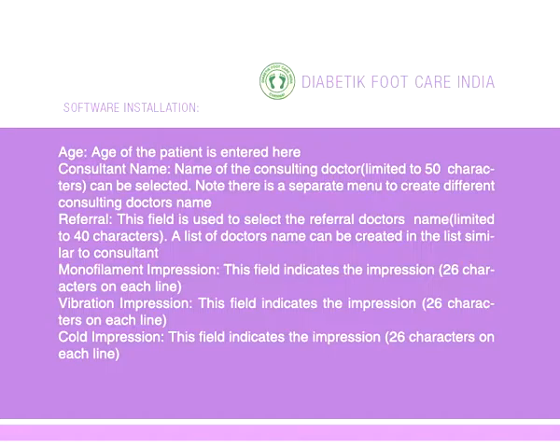Referral. This field is used to select the referral doctor's name, limited to 40 characters. A list of doctors' names can be created in the list similar to consultant. Monofilament impression. This field indicates the impression, 26 characters on each line.